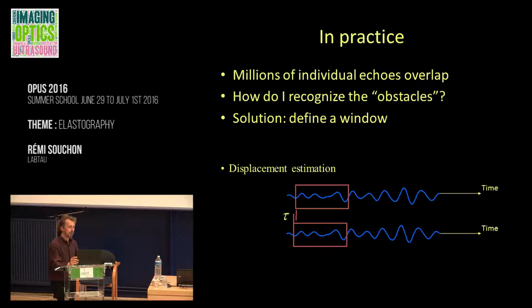And they actually create a signal by either constructive or destructive interference that creates this randomness in the signal. If you look at the true ultrasound signal, it will more or less look like the signals that we have here. You'll see some central frequency, that is the central frequency of the transducer, but you will see some varying amplitude depending on whether the interferences ended up being constructive or destructive.